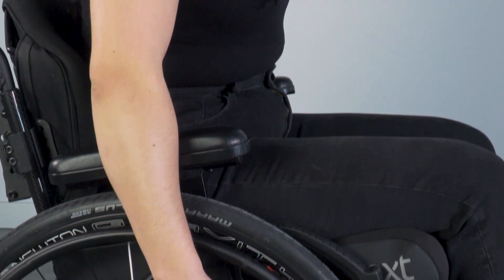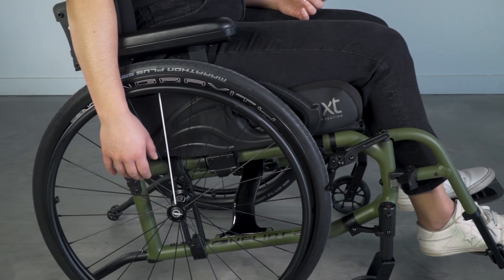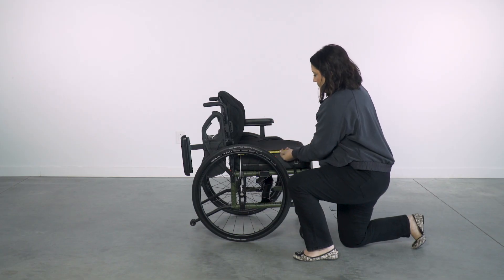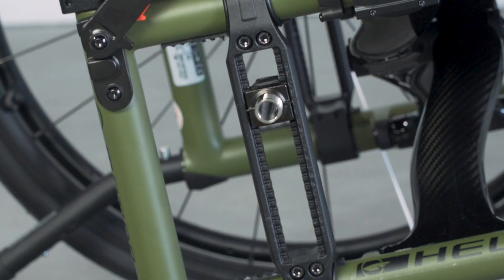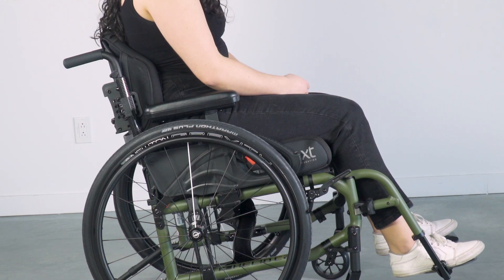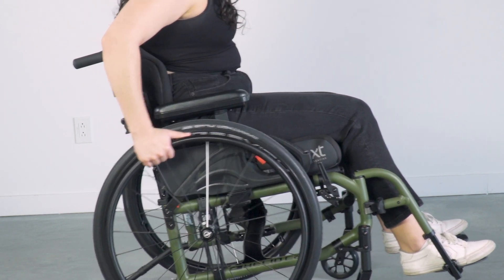Ideal is not the same for everyone. Here we have shown you a few tips and tricks on how to assess a client and make small, incremental changes to a wheelchair for significant impact on client function and satisfaction. Always remember to select a wheelchair model with proper axle range and increments that will allow you to meet proper client setup today and build in adjustability for potential future changes as well as skill acquisition.